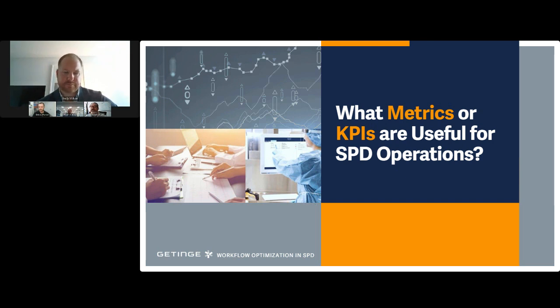What trends are they seeing on their ends, from an OR infection or other house-wide infection that we process for, in order to focus us in what we need to pay closer attention to. So whether it's immediate use data for sterilization, again, cleaning metrics, time and motion studies, there's numerous things that we can pick. But those are some of the critical aspects that I'll leave you with, and give a few other folks an opportunity here.